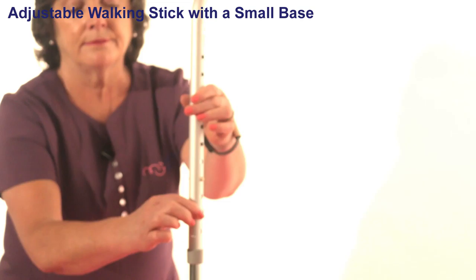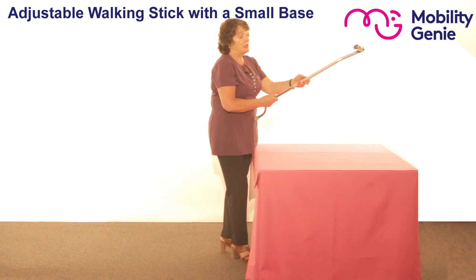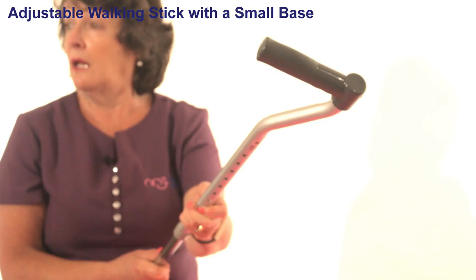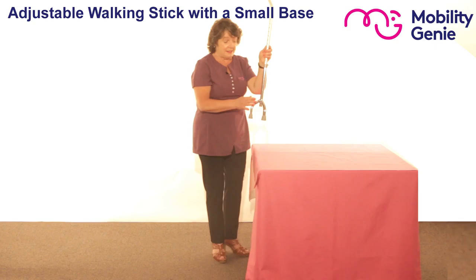To show you how to adjust it, there's a button at the front and at the back, and you've got holes above and below to adjust it to whatever height you think necessary. I find that by holding it towards me it gives me more strength to press in the two buttons at the same time, give it a slight twist and bring it up or down. Because the base is small, I can actually use that with my right hand or my left hand.